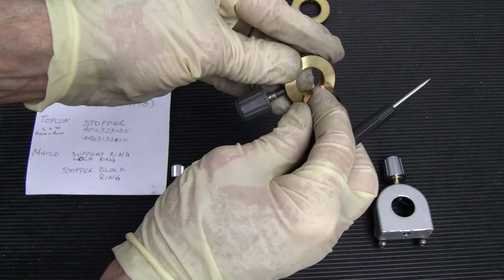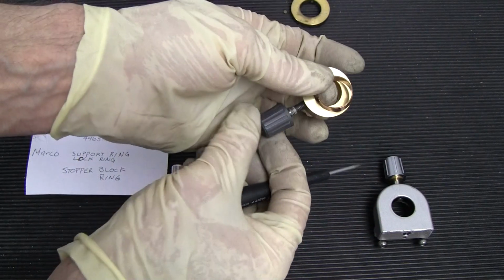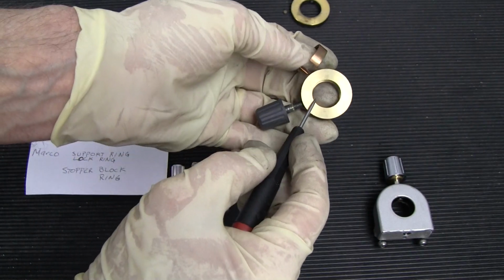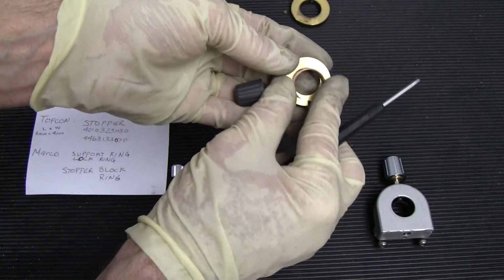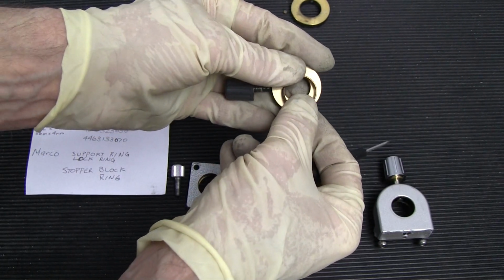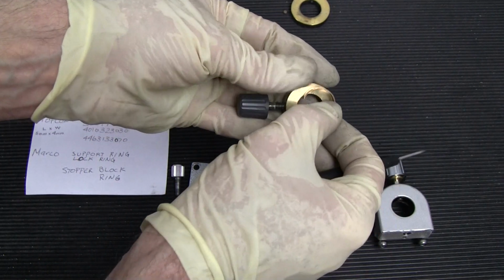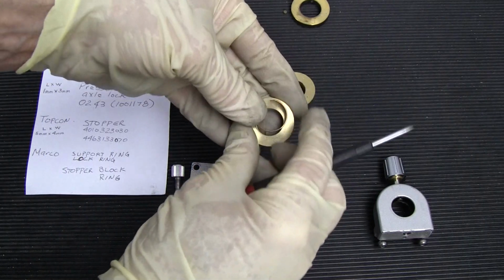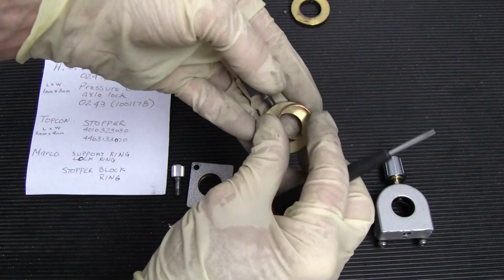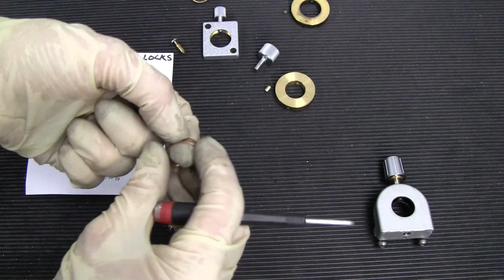They will slide back to this position right where the screw is going in. So it's just natural for it to move, and it doesn't move immediately. It takes a long time, but slowly but surely it starts to gravitate towards that opening. And you would want to go ahead and turn that so that you're pushing down on this rather than on the axle.